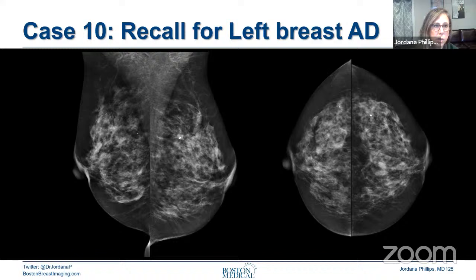So this was a patient who had architectural distortion in the left breast, marked by that yellow arrow. And we did a biopsy, a tomosynthesis guided biopsy. And you'll see that our clip is actually not where the architectural distortion was on tomosynthesis. So we weren't sure what to do about this. Did we sample appropriately the distortion and the clip moved, or were we just off? And this can happen with tomosynthesis guided biopsy. I imagine everybody on the call, or at least many people on the call, have had this issue.